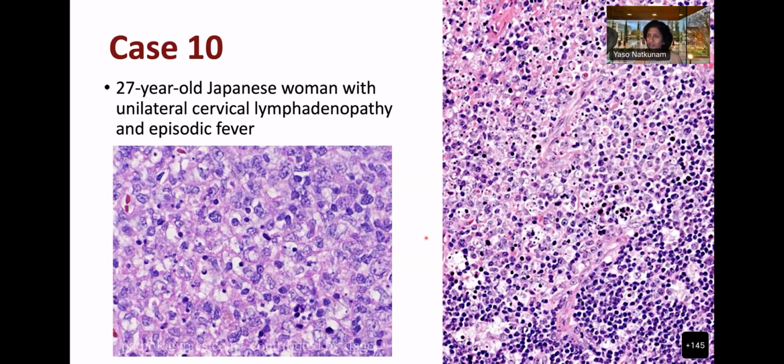I think two people have spoken quite a lot and given me wonderful answers. Somebody who has not spoken up yet, please tell me what other things are in your differential diagnosis. Sabah, Dilsha, Santa, and Kavita, any one of you, please try. I want one each from you. So this basically is a necrotizing picture, right? It's mixed up and doesn't really fit into any of the other big compartments we talked about. So the differential diagnosis is broad. The first diagnosis is a good one that was suggested, but I want each of you to come up with one more. Kavita, you've not spoken. Why don't you say something?